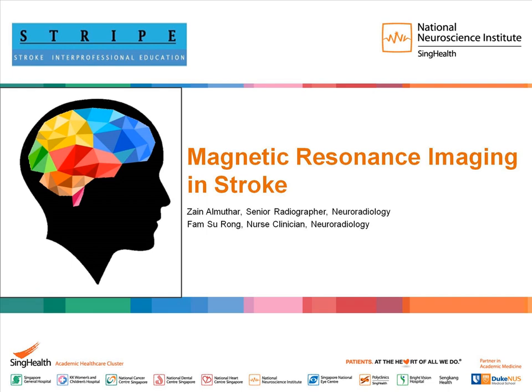Welcome to STRIPE, the Stroke Interprofessional Education Program. In this presentation, you will learn about the use of magnetic resonance imaging in stroke. My name is Surong and my colleague is Zain. We are from the Department of Neuroradiology, National Neuroscience Institute.